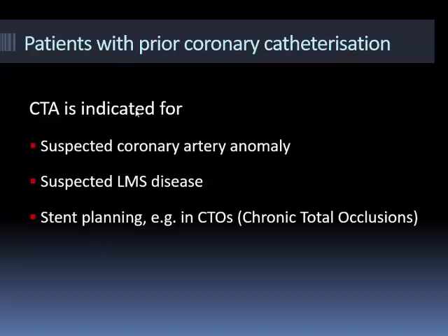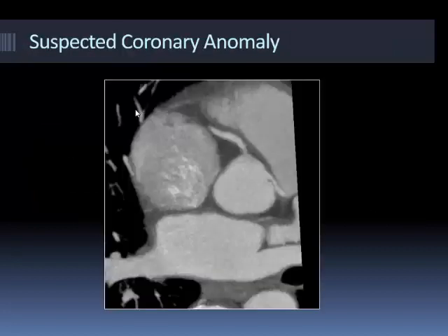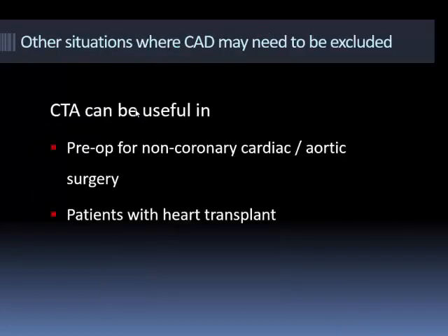Again, also in left main stem, we've had cases where for whatever reason they've done a cath, they haven't IVUSed the left main stem. There's a question as, is there a significant left main stem stenosis here or not, or is it just a kink? We've managed to do left main stem CT angiography. Can be a bit tricky when there's lots of calcium though, so it's not that easy sometimes. Okay, so this basically is a picture of a coronary anomaly, which you'll hear all about later.